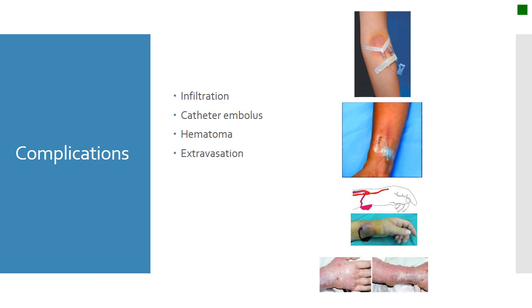Extravasation, as you can see, is when the fluid is being infused either too fast or not controlled enough, like through gravity, so that the vascular system cannot process it fast enough, and it starts to seep into the layers near that IV site. So this can be painful, burning, redness, swelling. You can get little pockets of swelling like this as well. You need to stop the infusion and notify the doctor. Different facilities have different protocols about what to do about this.